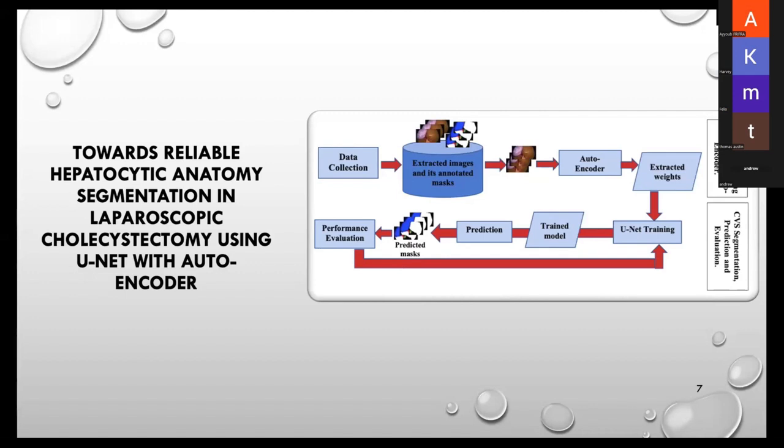This is the general procedure of our work. We start with data collection. We have data containing 200 videos of laparoscopic cholecystectomy surgery from the Computational Analysis and Modeling of Medical Activities research group, free videos from the World Laparoscopic Hospital, and free YouTube videos from the Society of American Gastrointestinal and Endoscopic Surgeons. We collected, extracted, and labeled around 1,550 images. They are free for anyone who wants to use them in their research. I am happy and glad to help. I already uploaded them to one of the free websites as a data set that anyone can use.